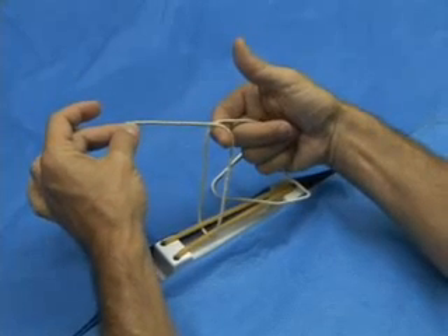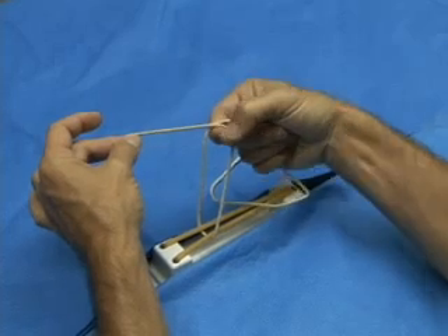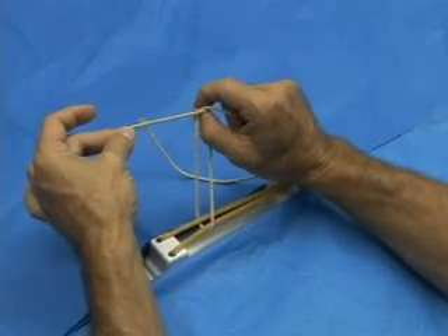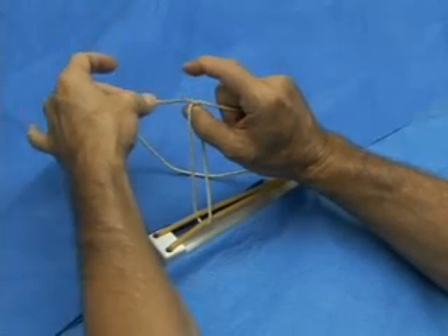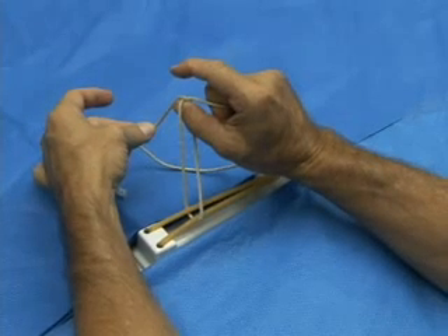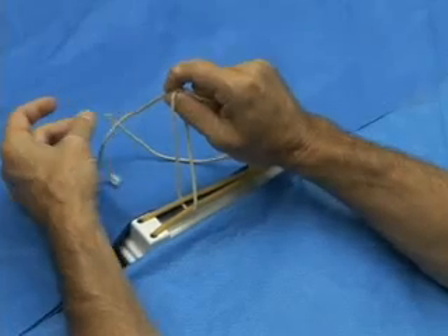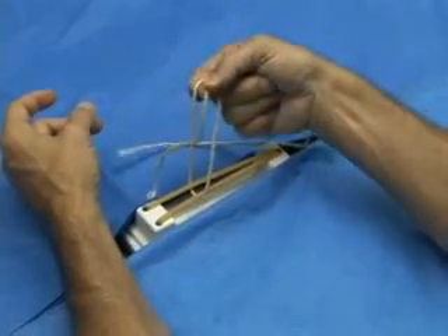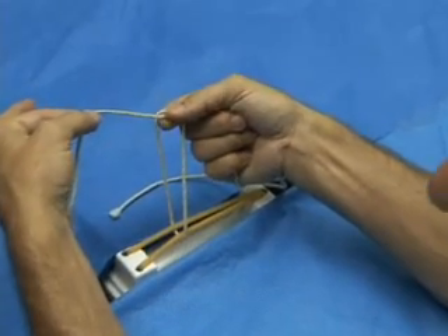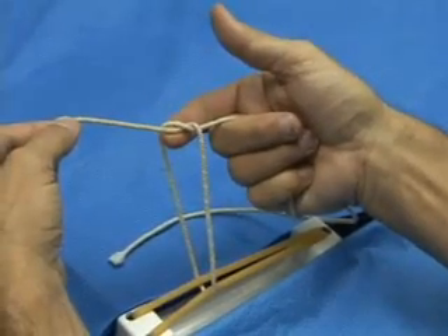The way we're going to do that is to pinch the thumb and forefinger together, pass those under the loop we've created, then lay the strand from our left hand across the thumb of our right hand, pinch that strand, and use that to convey that left hand strand back under and through the loop.